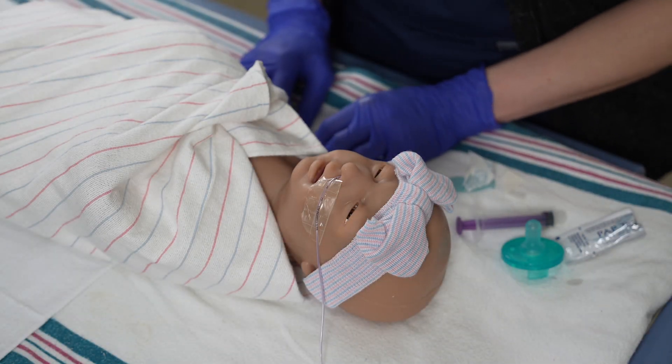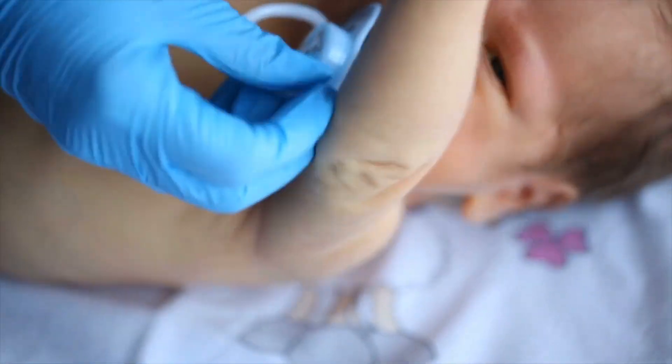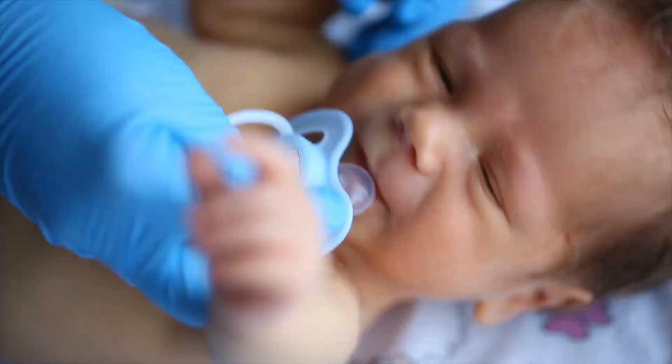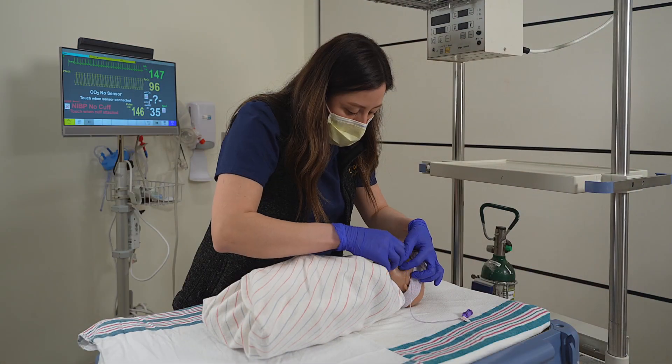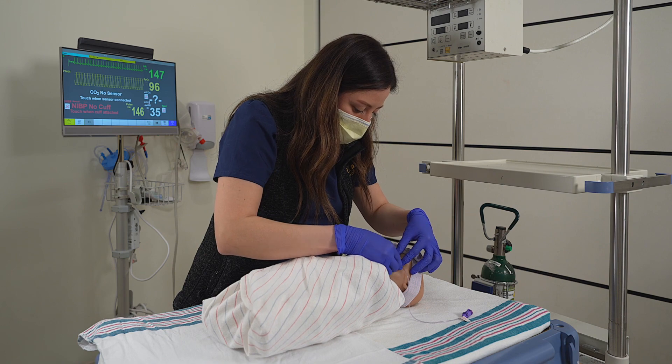The procedure will feel uncomfortable for the infant, causing them to cough and gag. Offering the infant a pacifier may help the tube to be inserted easier and provides comfort. While inserting the tube, monitor the infant's vital signs, including heart rate and respiratory rate.